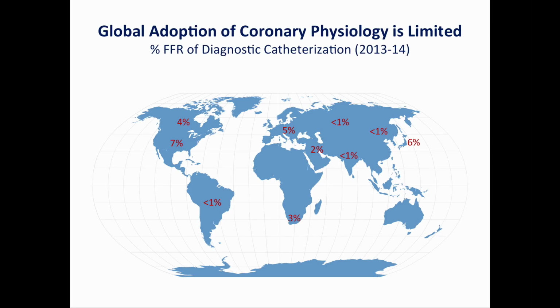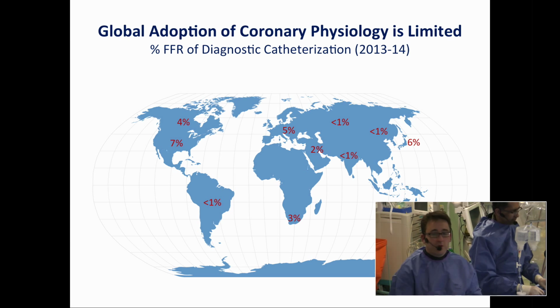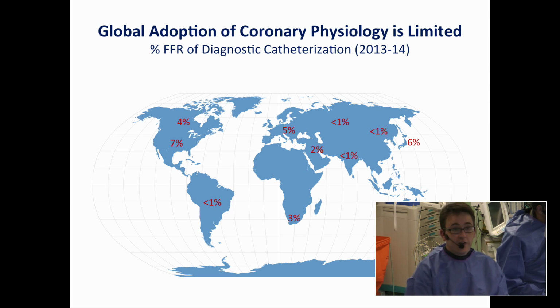Now, we've got all of this evidence, but to me this is a staggering graph, because we see that despite evidence which is rife, people are only using these techniques around the world in a very few number of cases. And this is from a diagnostic perspective, so this is a number of times a pressure wire is pulled out and used in assessment during a diagnostic angiogram case, and you can see that the numbers here are very, very low. Hotspots: the United States, Western Europe and Japan, but a lot of the rest of the world, the numbers of wires being used, at least in 2013 and 14, was low. I think these numbers are increasing, but you can still see they're somewhat lower than you'd expect from the level of evidence that we have to date.